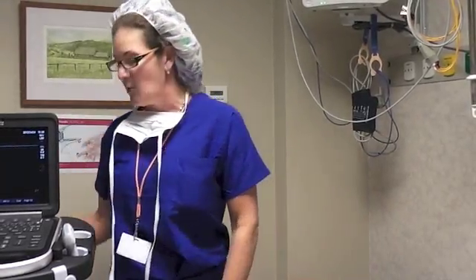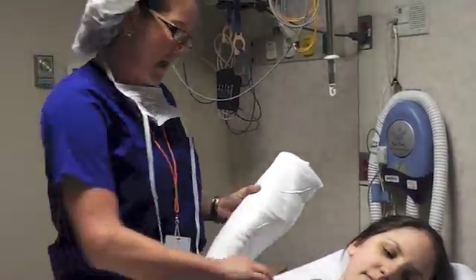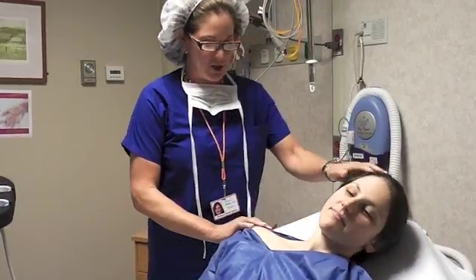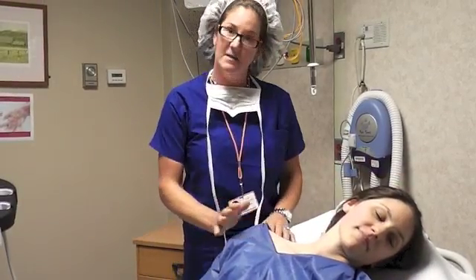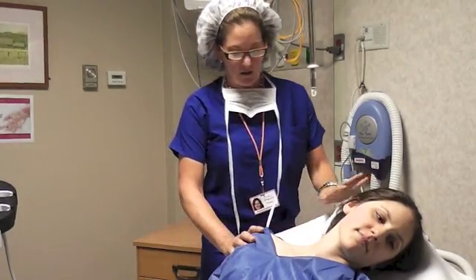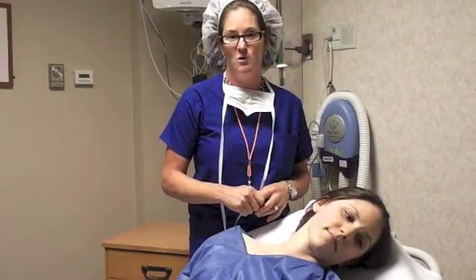The first thing we're going to discuss is the importance of positioning and how critical it is to achieve success. In the case of an interscalene block, we place the patient in a semi-upright position on a stretcher in our block room. I place a folded towel underneath the patient's scapula to optimize positioning. Then I ask the patient to turn their head away from the side of the block. In this case, we're going to be doing a right-sided block, and you can see this patient's field has markedly improved, giving me much better access to a posterior approach, which is our preferred approach for interscalene catheters.